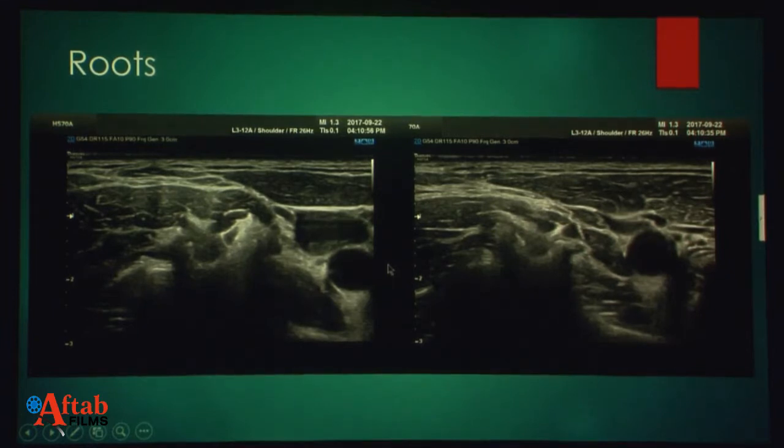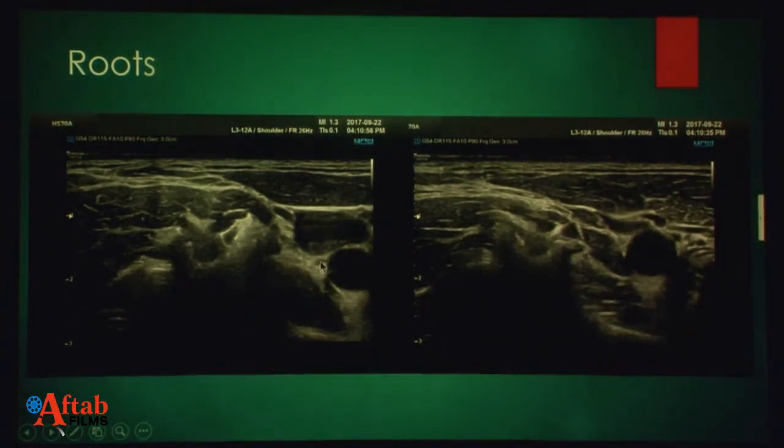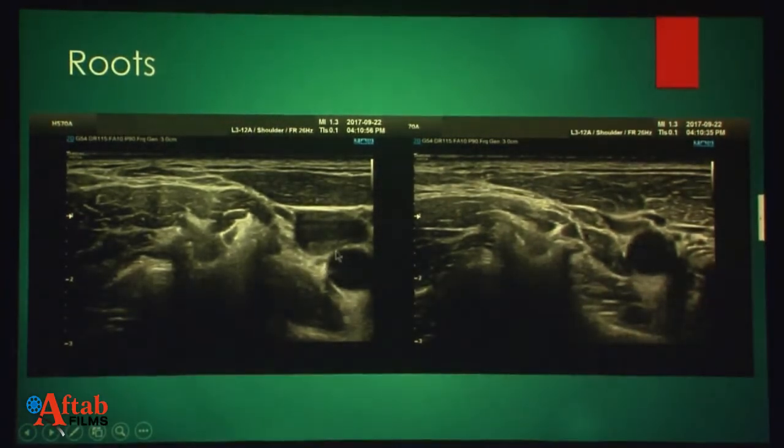We will talk about the landmarks, but we have our carotid artery. You have the internal jugular vein. In between the two, you see a small speck here, a hypoechoic area. That's our vagus. I'm sure each one of us has seen this enormous number of times when we are doing our thyroid scans. But we miss out on this small little thing, which is the vagus. And if you just move your probe tomorrow, if we have the time, this vagus moves in and out very beautifully.